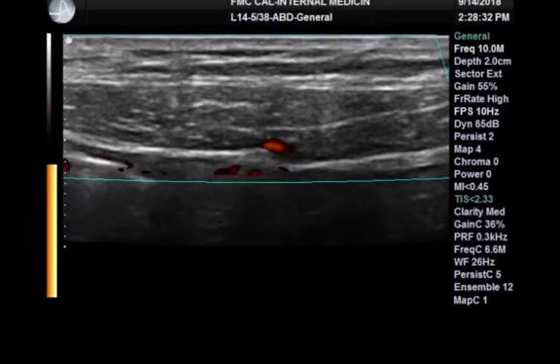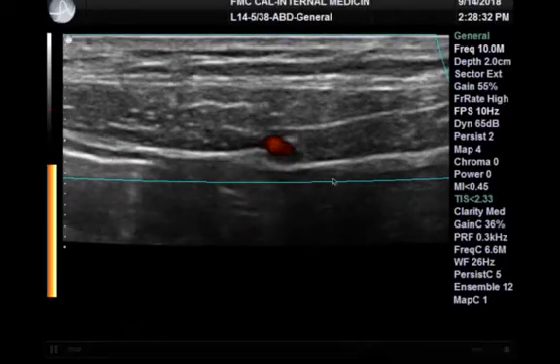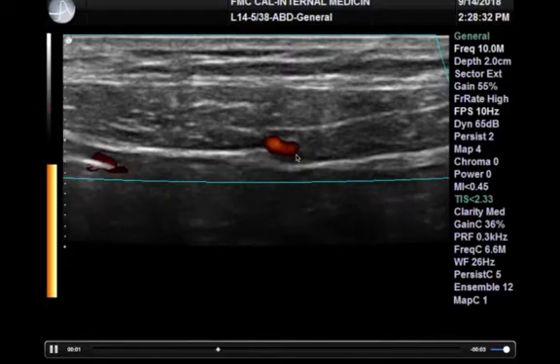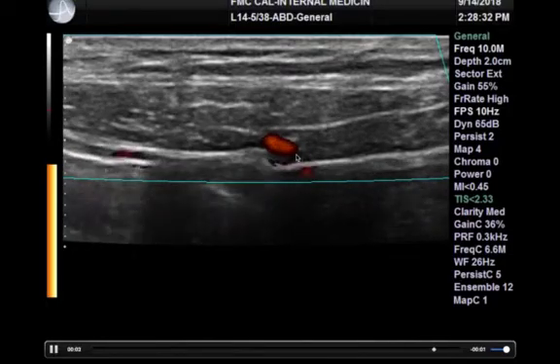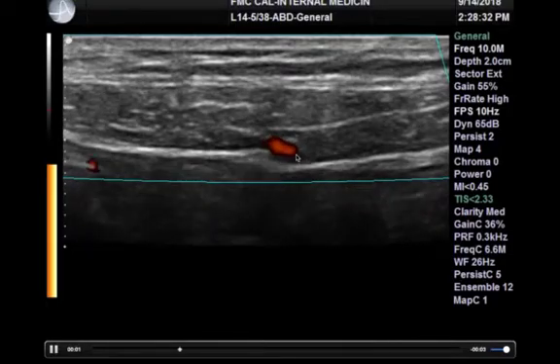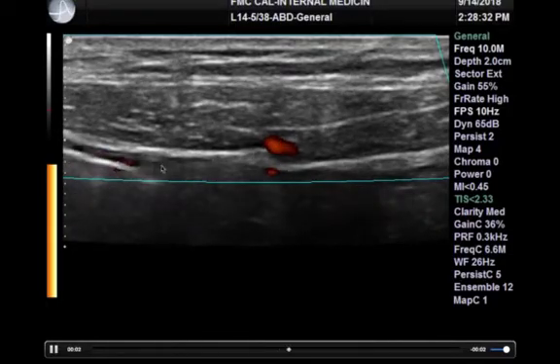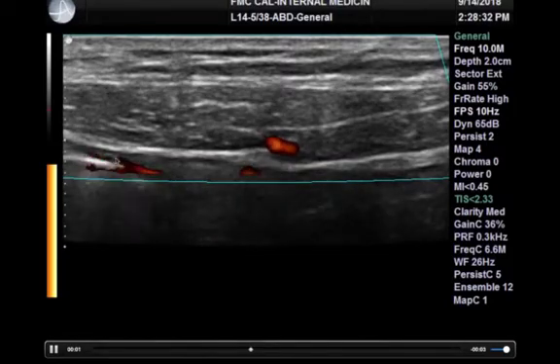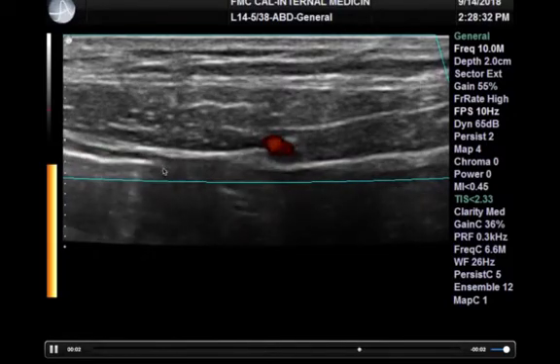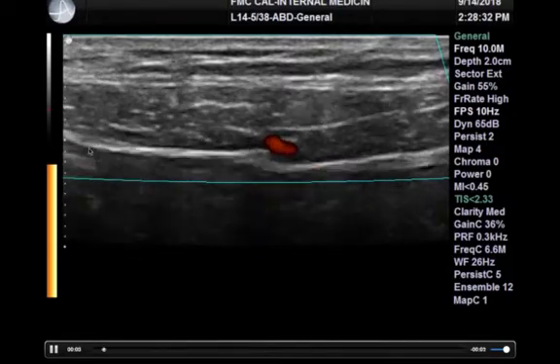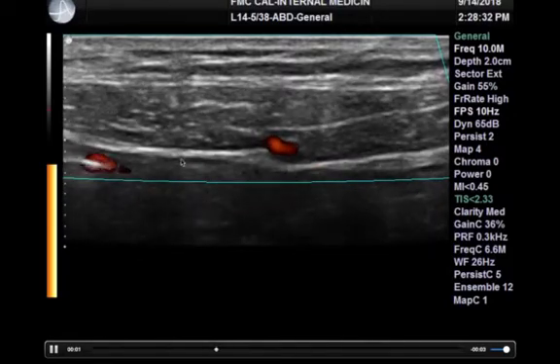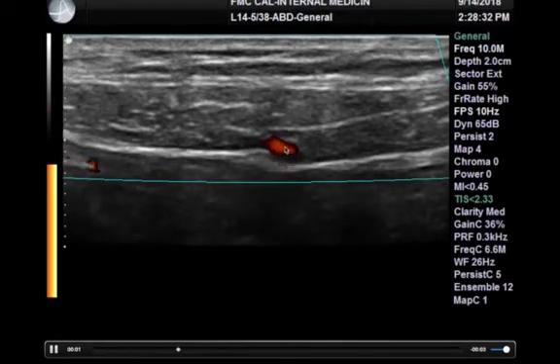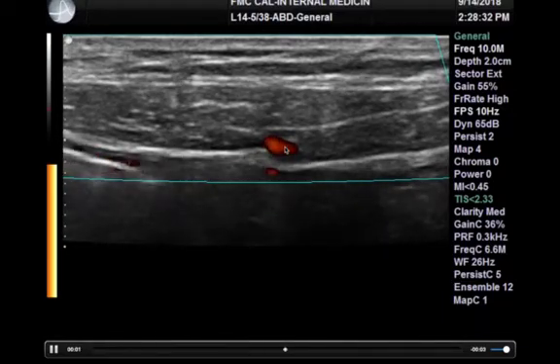Throwing on Doppler, this is what that would look like. It's this persistent signal that tells me there's a blood vessel running underneath. These other areas showing random movement artifacts — such as the bowel moving — light up inconsistently, whereas this signal definitely is consistent and persistent.